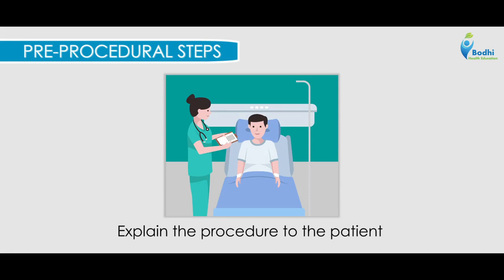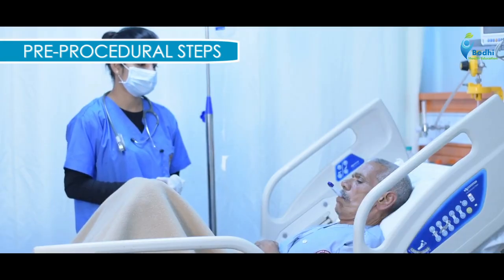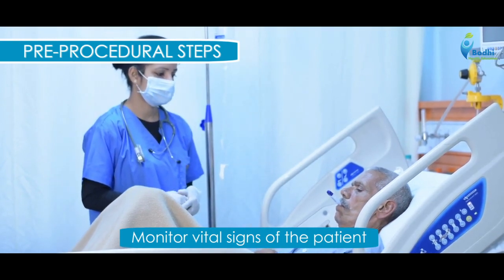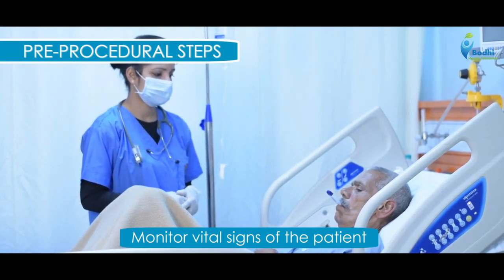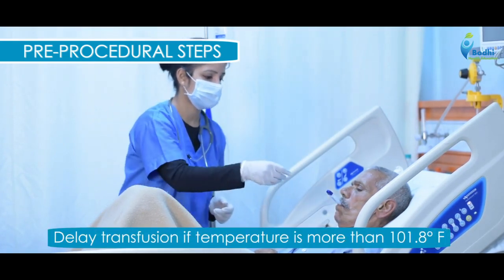Explain the procedure to the patient, need for transfusion, blood product to be given, approximate length of time, desired outcome, etc. to provide reassurance and facilitates cooperation. Obtain informed consent from patient. Prior to administration of blood, the patient's vital sign should be recorded correctly to provide a baseline for further observation.